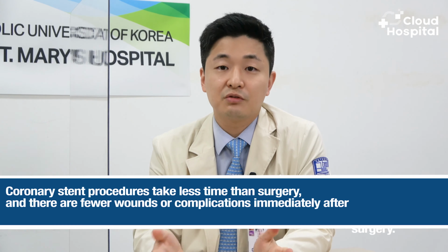So, why is this method better than normal surgery? Coronary stent procedures take less time than surgery, and there are fewer wounds or complications immediately after the procedure. In general, the procedure takes about 1 to 2 hours. If the procedure proceeds without any problems, you'll be discharged the day after the procedure. Therefore, if it is not contraindicated, the doctor primarily recommends treatment, not operation, to the patient.